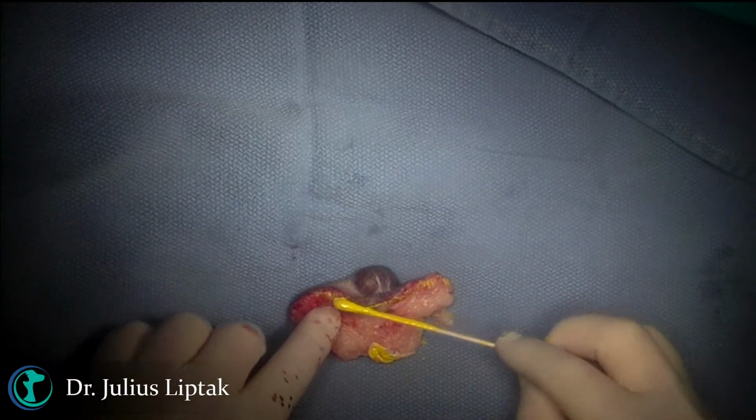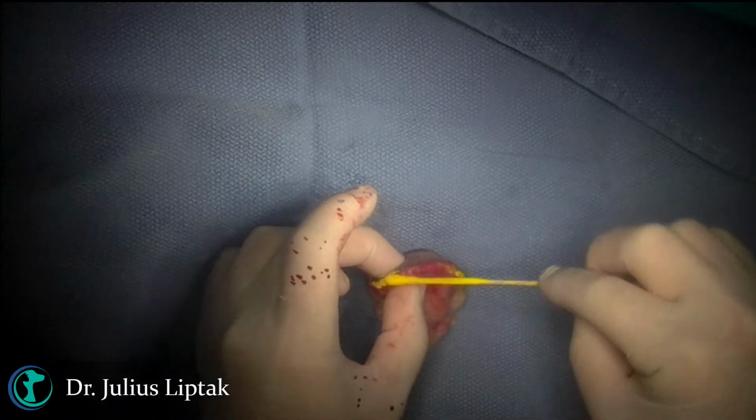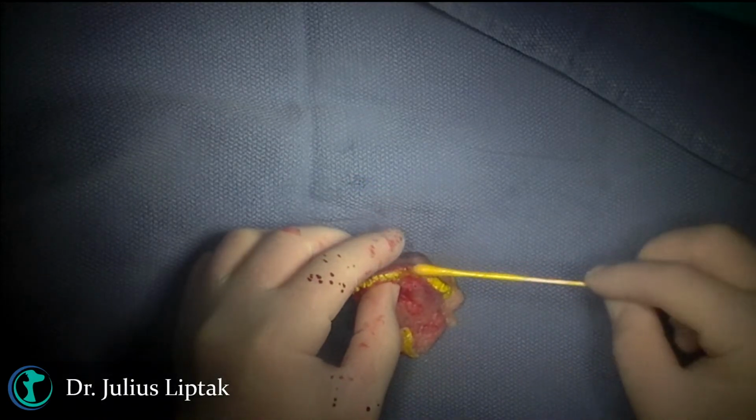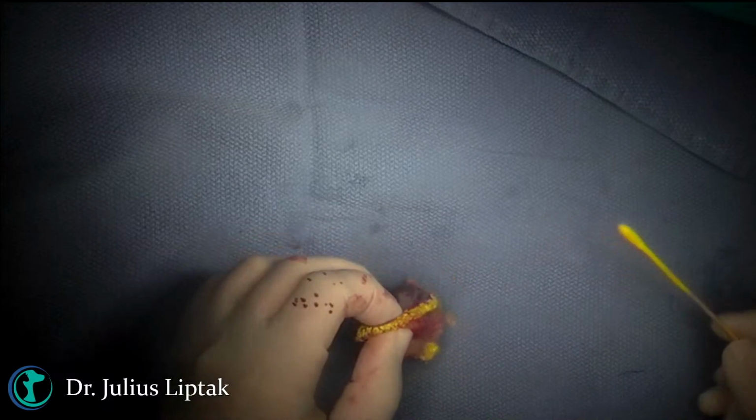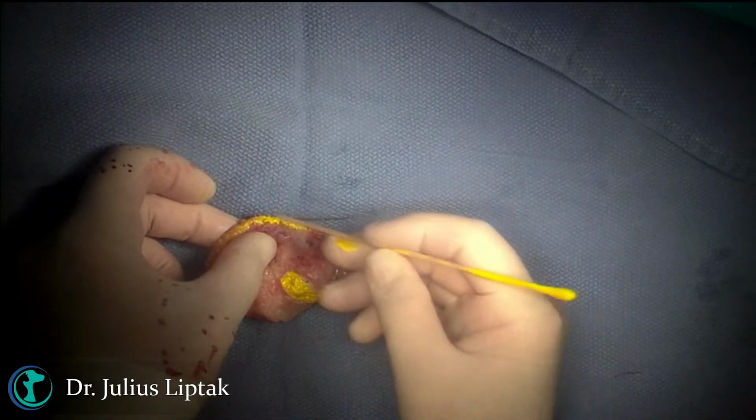Okay. And we're going to let that dry for about 5 minutes before we put it in the formalin. So there's our margins marked, deep margins and our lateral margins.